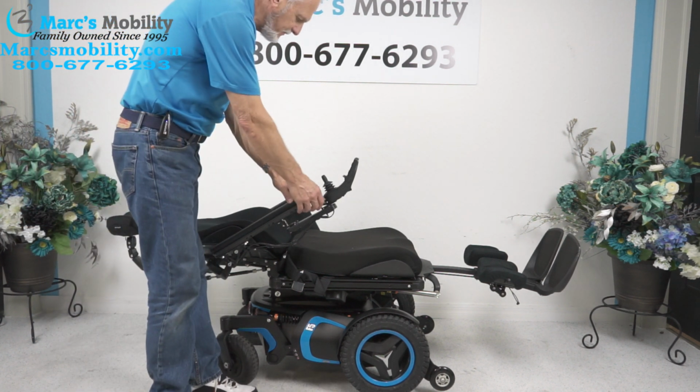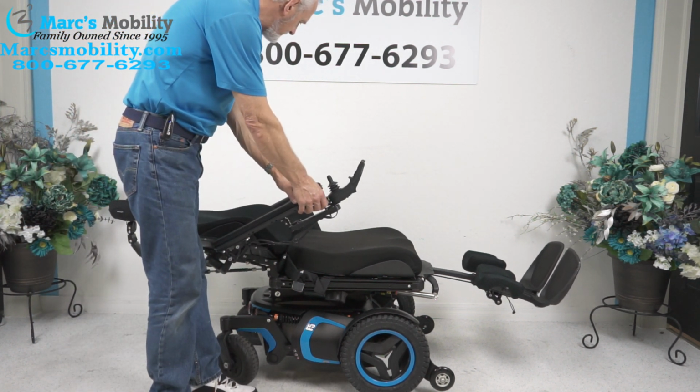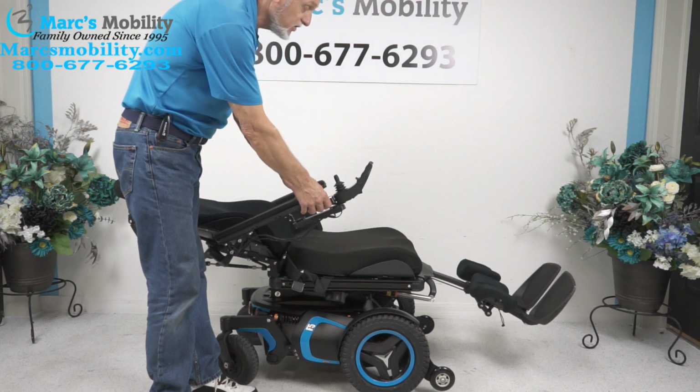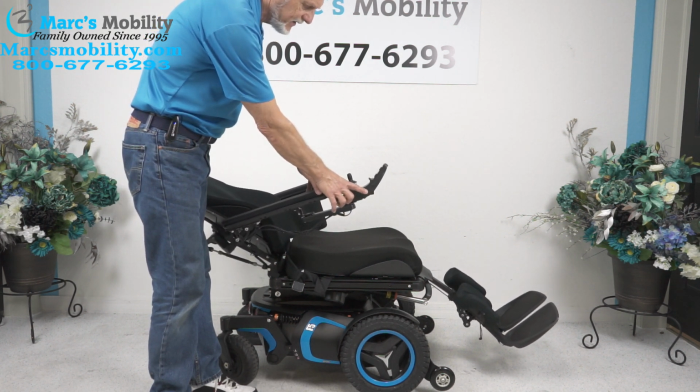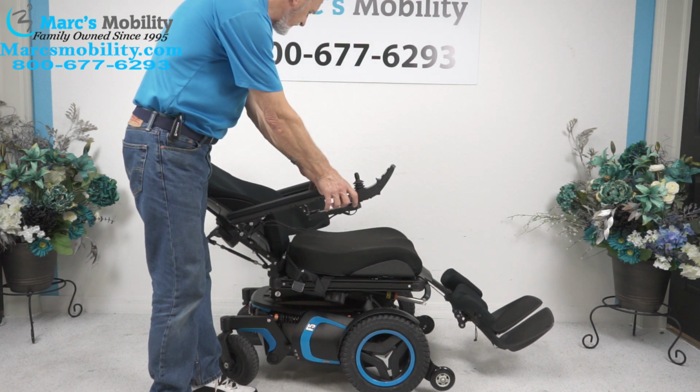So I'm going to bring the seat back up and the legs back down. You can do two functions at once, like I'm doing two buttons. You can do two functions at once through the joystick with just one single button. I'm doing this to save time here.